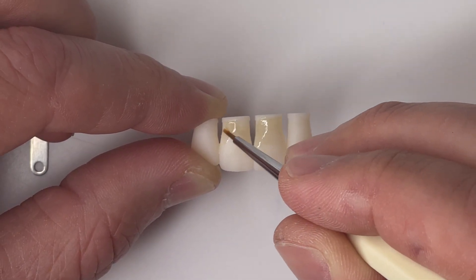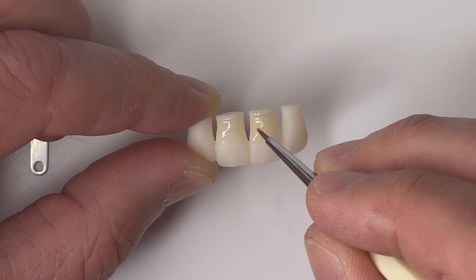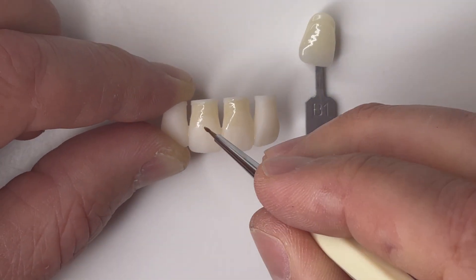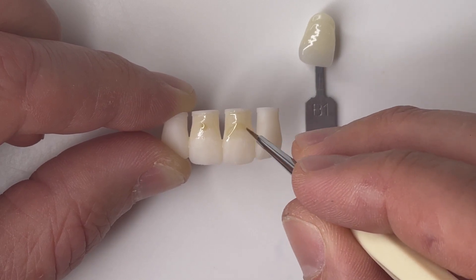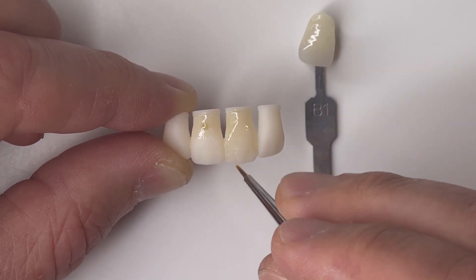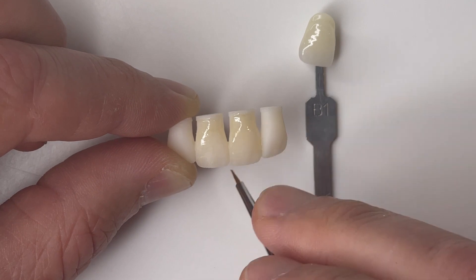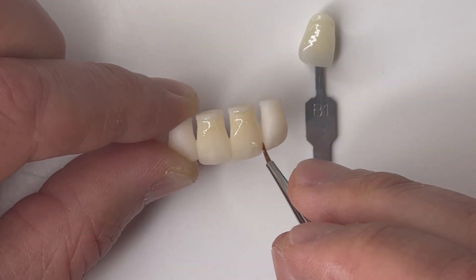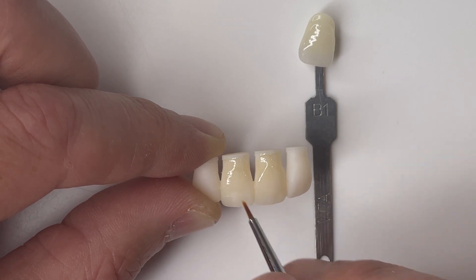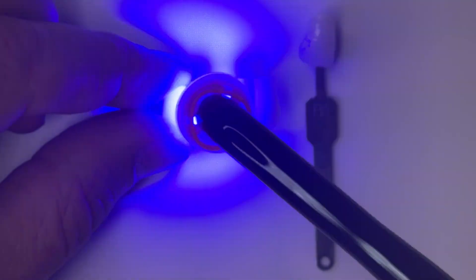Starting on that cervical and with each layer progressing little by little towards the incisal edge, curing each time to make sure we set those layers. The cure speeds are sped up so I'm not boring you watching these restorations get cured. Always putting my stain on the tooth in the cervical and then dragging it towards the incisal — that way if you get a little bit of pooling, it's in an area where you want the most chroma anyway. If you really study anteriors, you know they have a decent amount of chroma up into the middle third of the tooth.